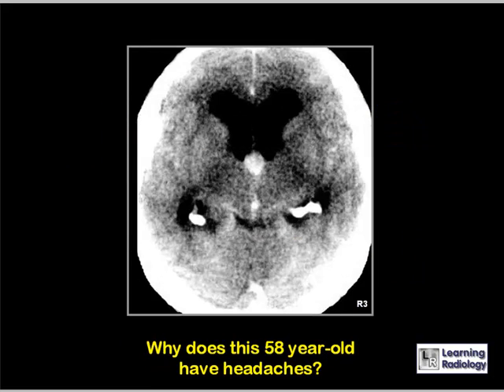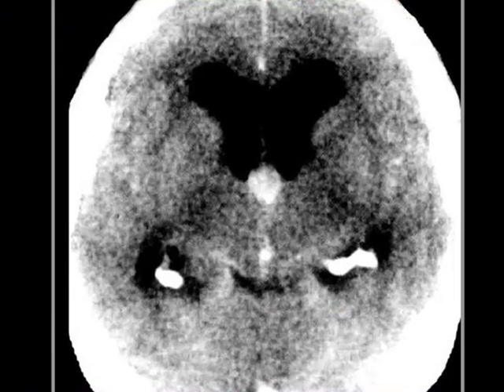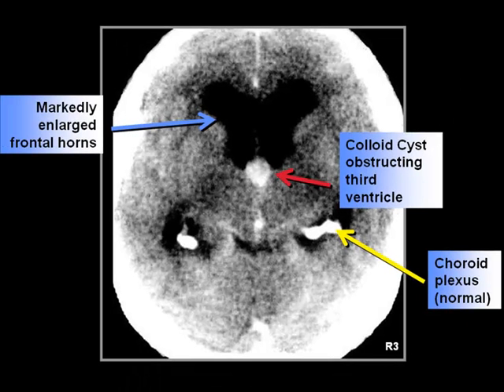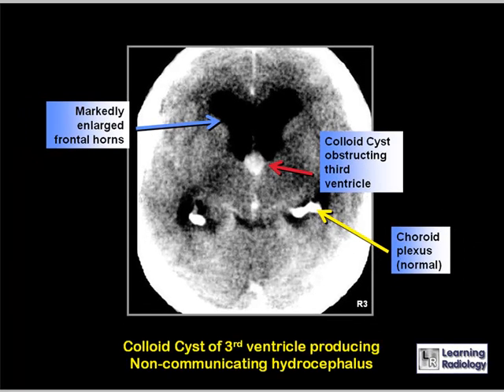Why does this 58-year-old have headaches? There are markedly dilated frontal horns of the lateral ventricles (blue arrow), produced by a mass sitting in the third ventricle that is obstructing them. This is a colloid cyst obstructing the lateral ventricles. The yellow arrow points to a normal structure, the choroid plexus, in the occipital horns. This is a form of non-communicating hydrocephalus produced by the colloid cyst.